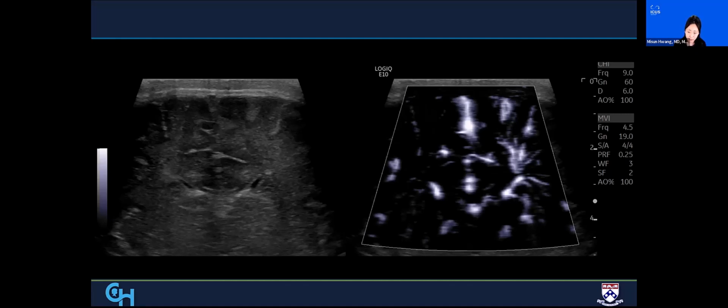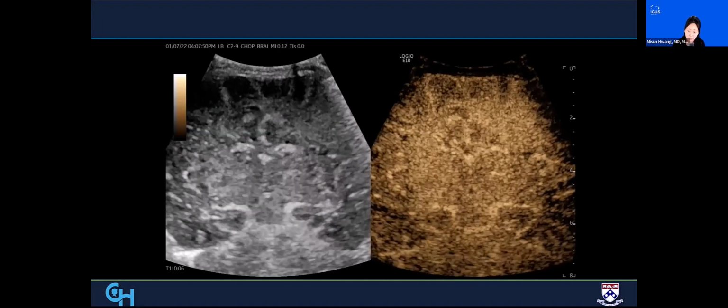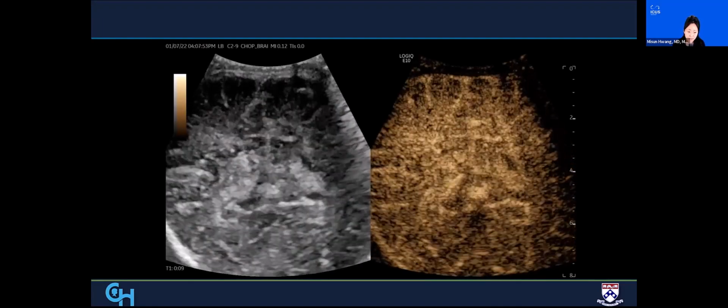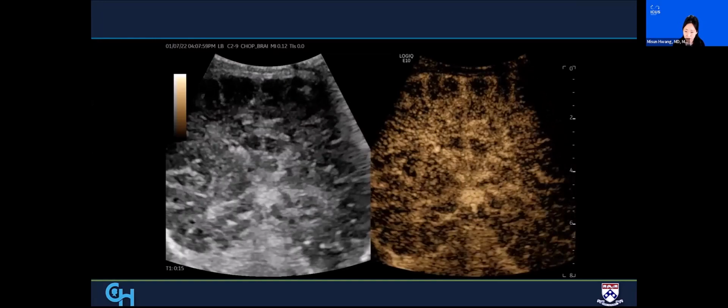And what you're noticing is that there is a suggestion and actually the presence of asymmetric perfusion in the brain. Most notably, the left side is more perfusing in the deep medullary veins, maybe the perigyral vessels. But we're still not sure what may be going on. Is this true? Is this artifactual? Well, we try to confirm that at the bedside by injecting contrast, and voila, there is marked perfusion of the left frontal lobe, and posteriorly you're not seeing that effect, so we know that it's isolated to the left frontal lobe.